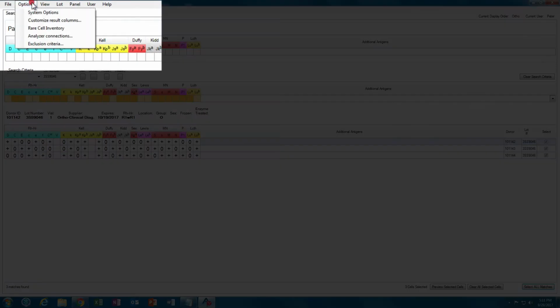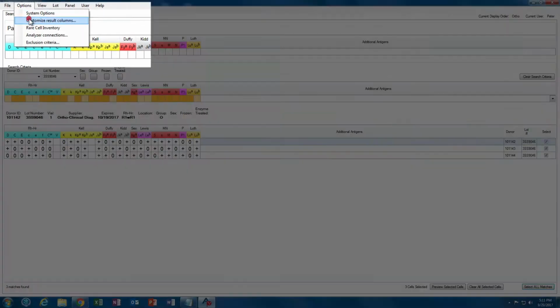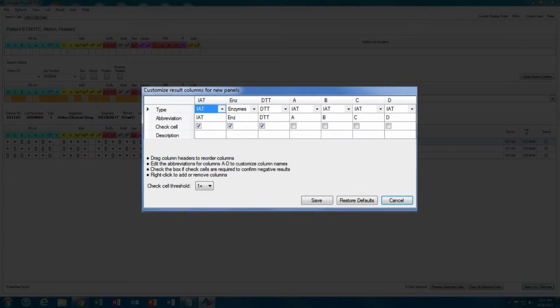Going back to the Options menu, we can look at decisions you may make for your own default worksheet and how to implement them. Later, we will look at how to customize a worksheet for use in an individual workup. We will assume for this demonstration that your usual procedure is to do 2 spin tests and a tube test to do your antibody ID. The basic steps will apply to any arrangement you wish to start with.